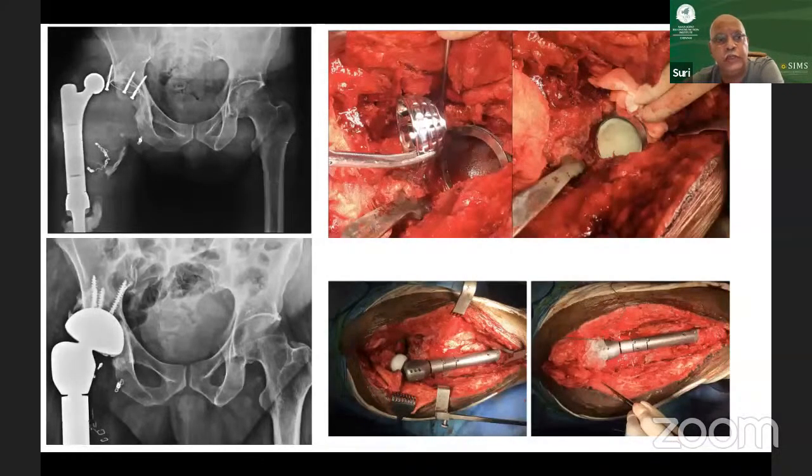Or these sort of major tumor resections, and this was a major resection, what you have done, just get a trabecular cup, then you cement in a liner, and then use a dual mobility. Basically, that helps you because abductor is very much in question in these cases.